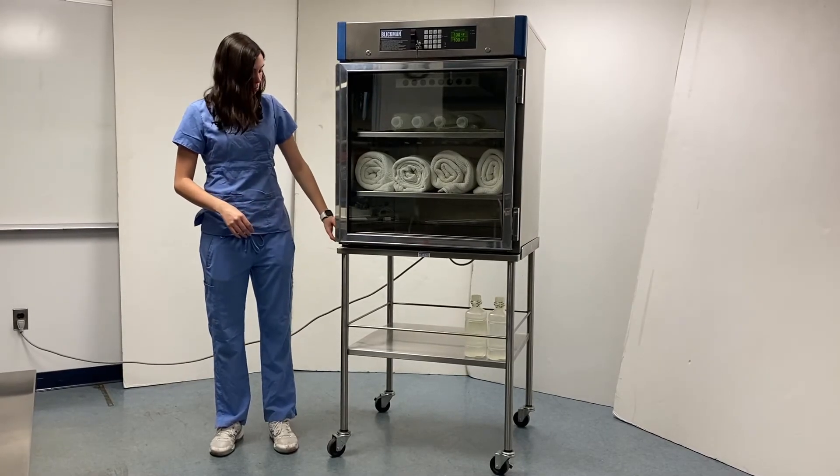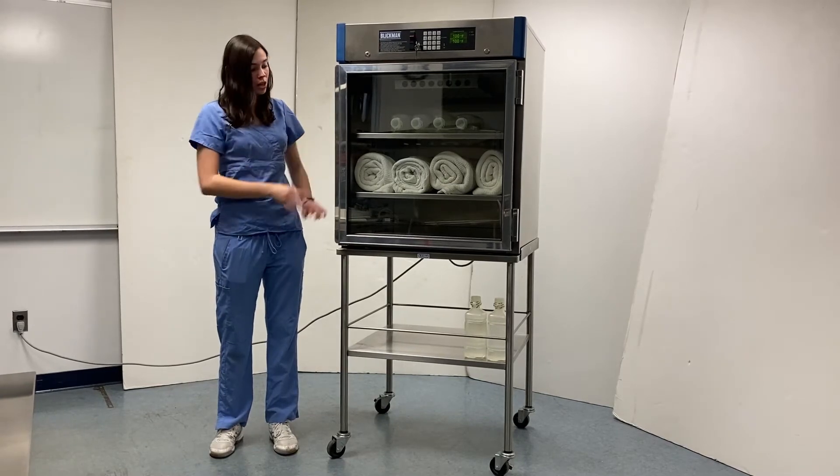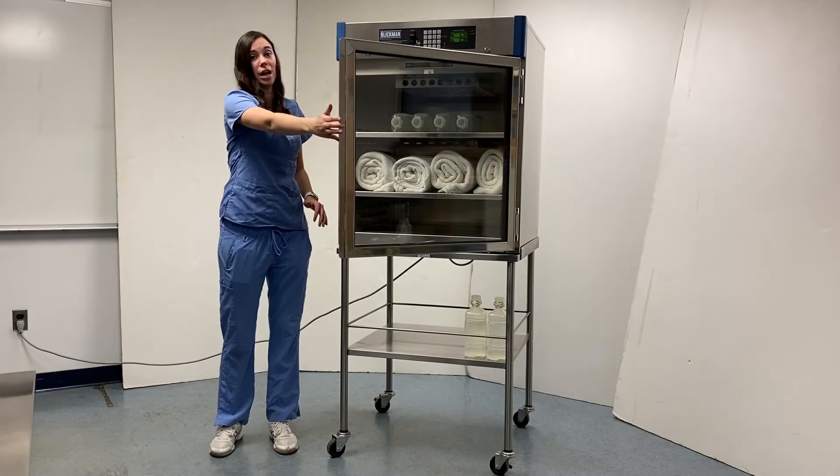Additionally, the top part has three sides that securely hold our warming cabinets in place, with an open front edge that allows for access to the warming cabinet.